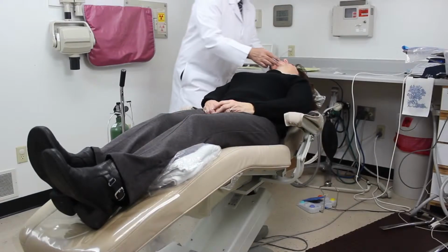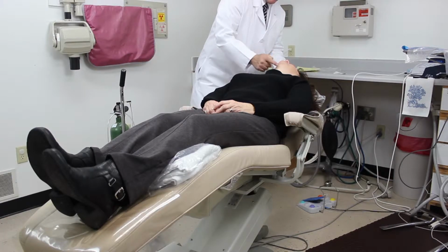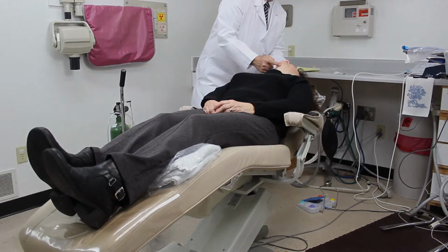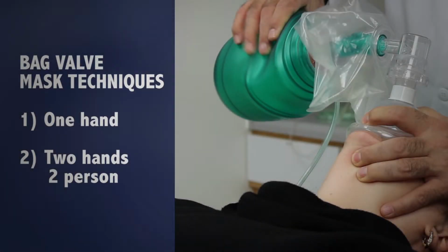Again, head tilt, chin lift, look, listen, and feel. Of course, if we've given any medications, we want to reverse them, and we want to help them with respirations. The best device in this armamentarium is the bag valve mask. The bag valve mask allows us to breathe or help breathe for the patient.